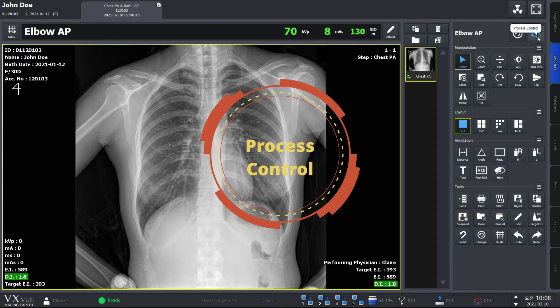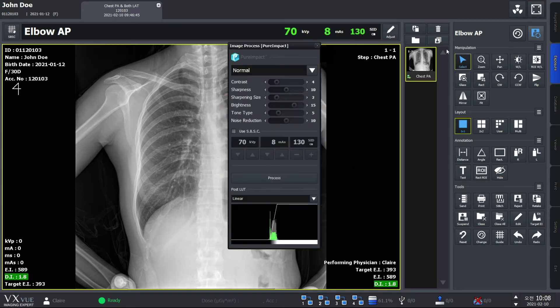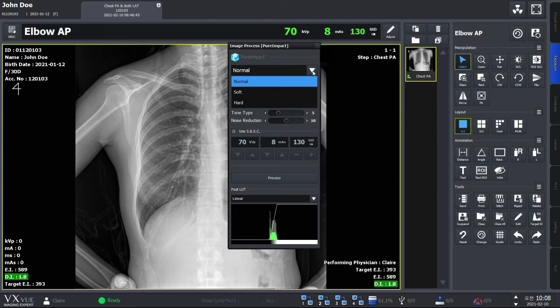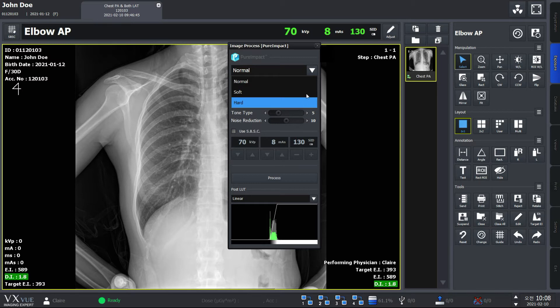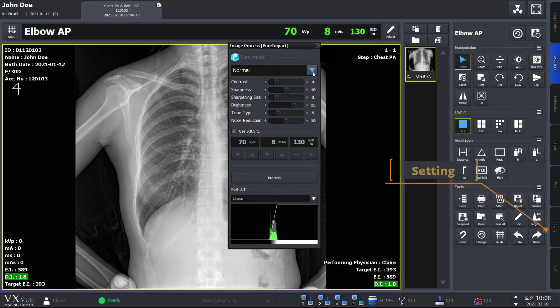Second, Process Control. Process Control is a tool that helps you adjust the image processing parameters to achieve the best image quality. VXView provides three predefined parameter options for you: Normal, Soft, and Hard. You can preset a default parameter from the Procedure Manager in the setting mode. Should you have a specific parameter you wish to use or change, you can adjust the image processing elements here.